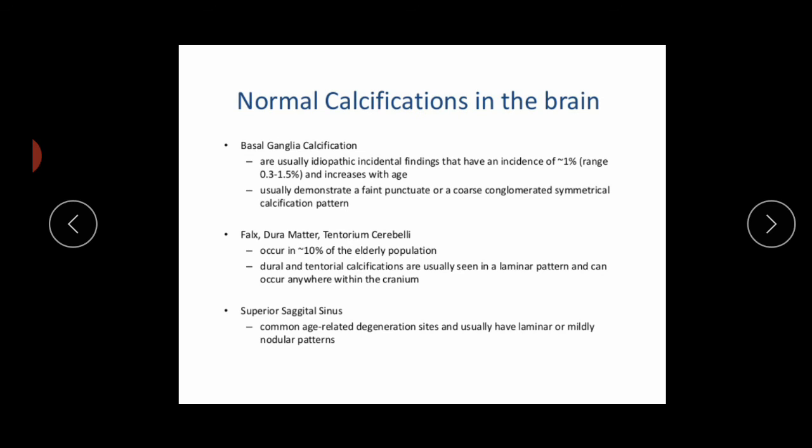Basal ganglia calcifications are usually idiopathic incidental findings with an incidence of less than one percent, increasing with age. They usually demonstrate a faint punctate or coarse, symmetrical calcification pattern. Falx dura mater and tentorial calcifications occur in less than 10% of the elderly population and are usually seen in a laminar pattern, and can occur anywhere within the cranium.